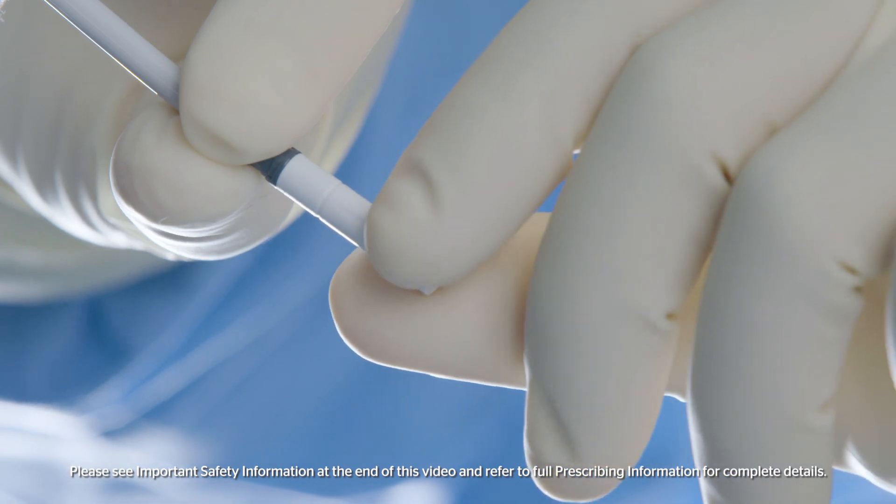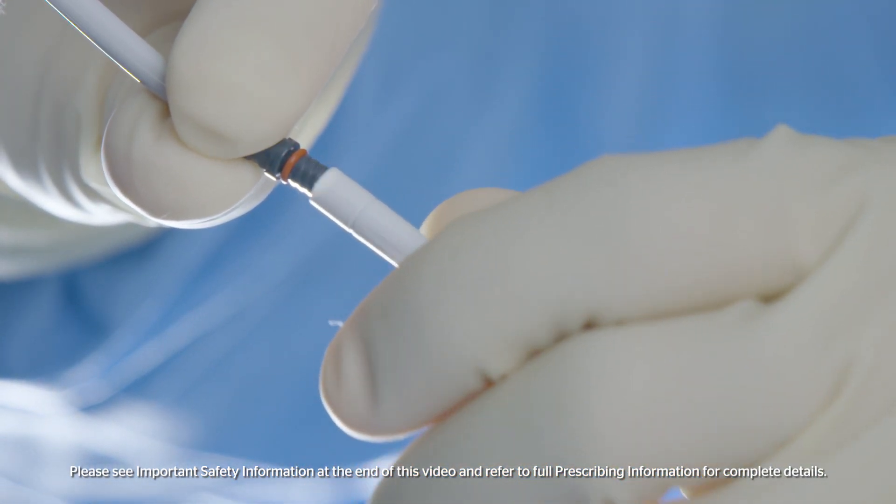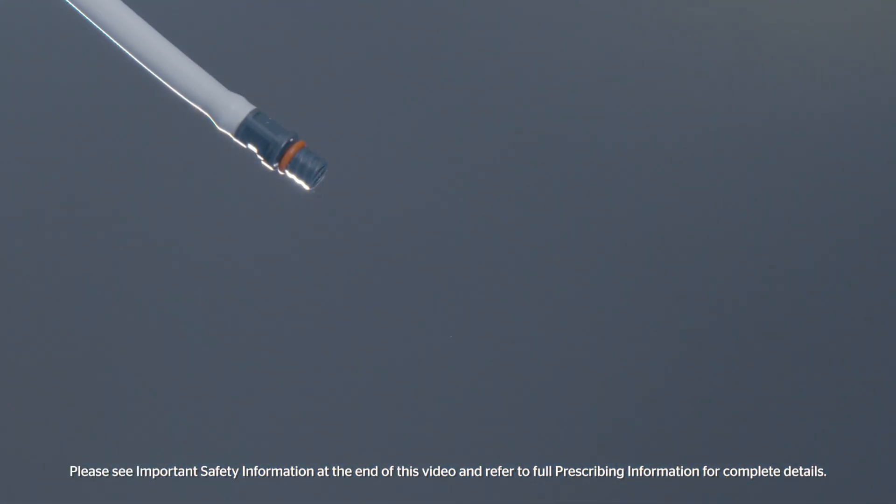Remove the airless spray tip by unscrewing it from the tip connector and keep the tip as close as possible to the tissue surface without touching it. Apply individual drops to the surface area to be treated. To prevent uncontrolled clotting, allow the drops to separate from each other and from the end of the tip.